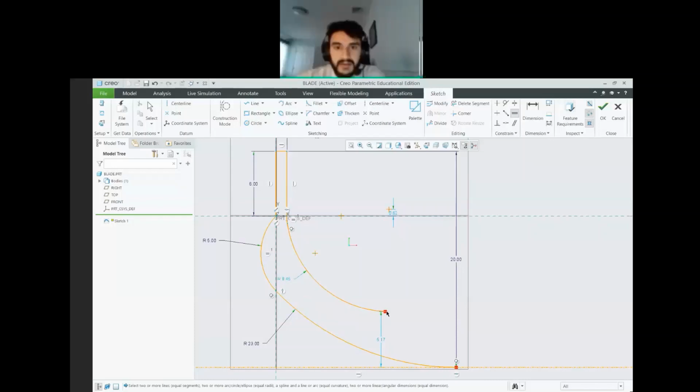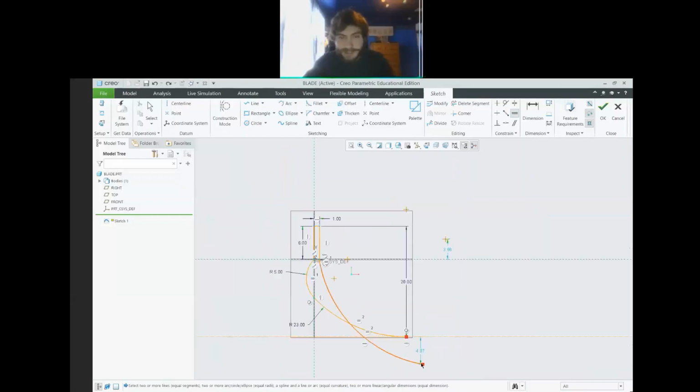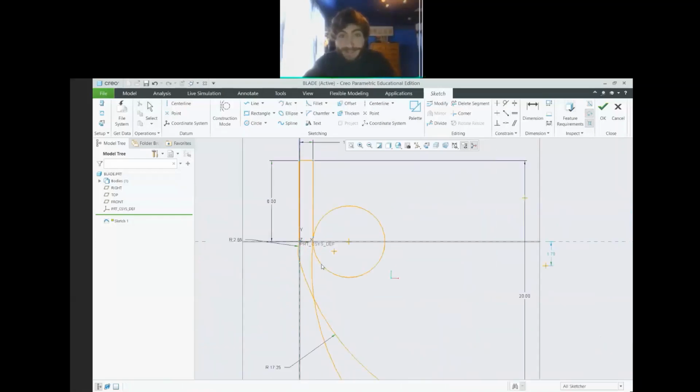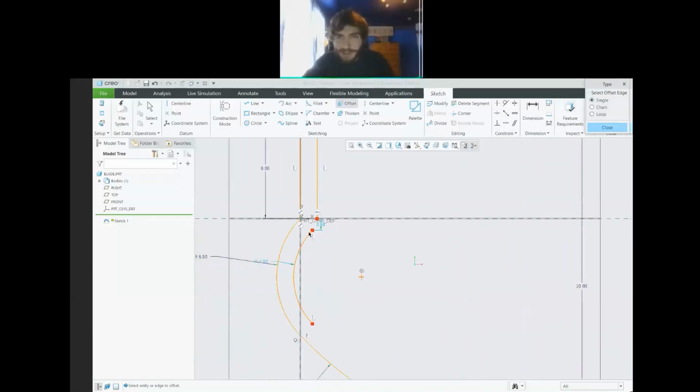Would we be able to use the offset tools? Yes, you could. Absolutely. Let me see if I'm doing this. All right, that's way weirder than I thought it was going to be. Never mind, offset's easier. That's odd. All right, so we'll click the offset. We can do single, that's fine. And we type in -1, just because we have the arrow the wrong way. Yeah, sometimes it does that.